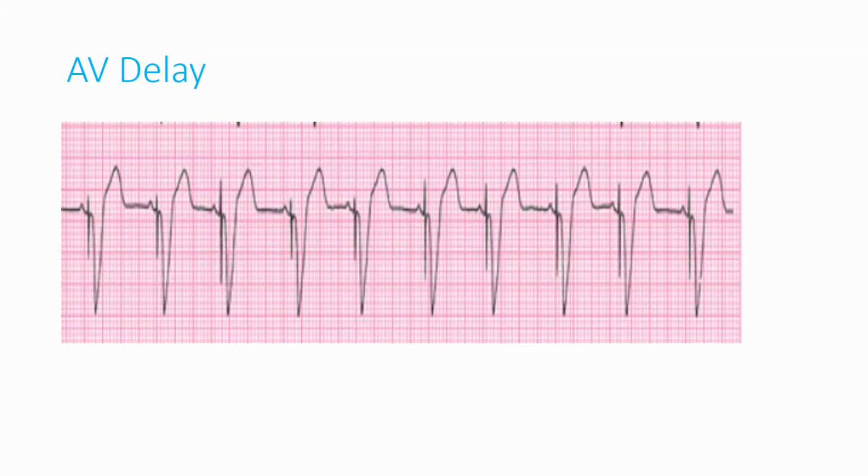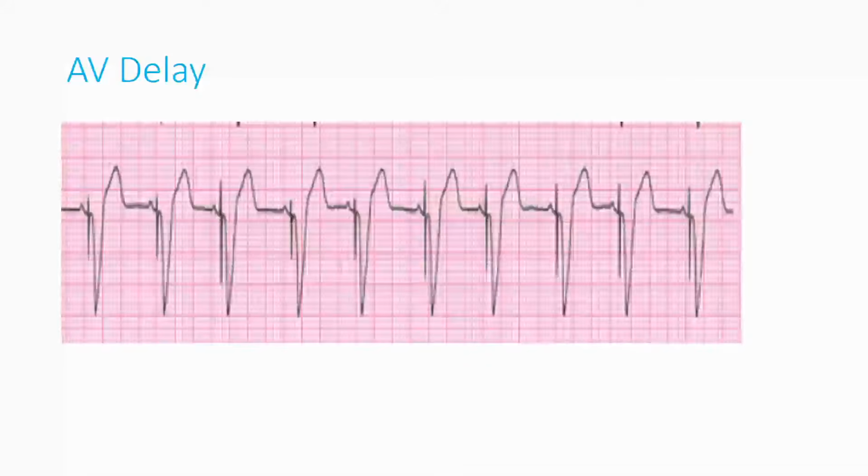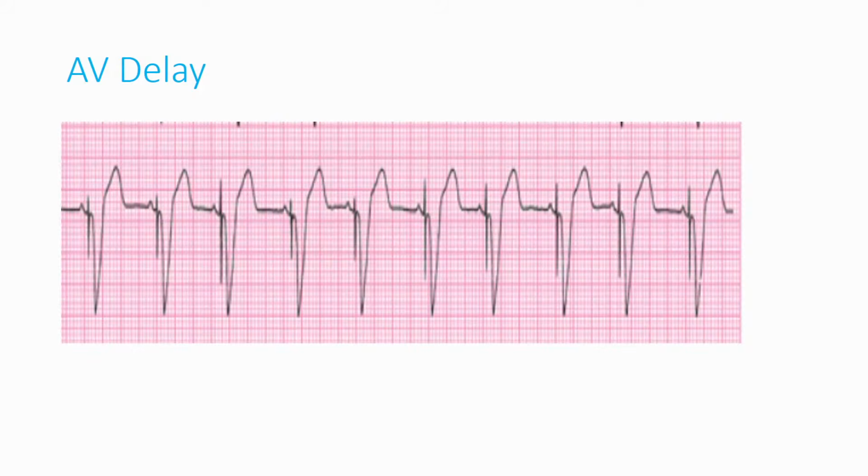This is one example, but there are patients with left atrial dilatation who have a wide P wave. In the wide P wave, the sensing happens in the first part of the P wave, and then you might have programmed an AV delay of 130 or 150 milliseconds in the pacemaker. So at the end of the P wave, it will be paced immediately and the QRS will be generated. So it will be AV fused if you look at mechanical function in echo.